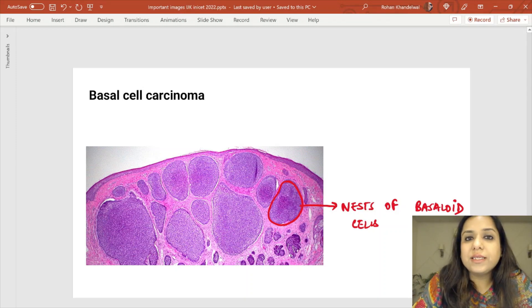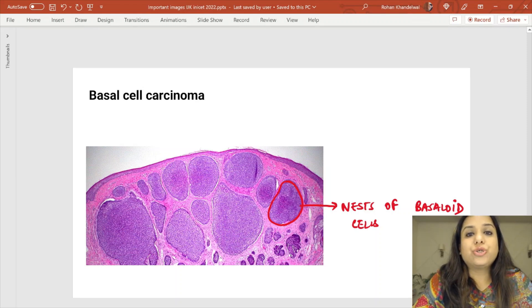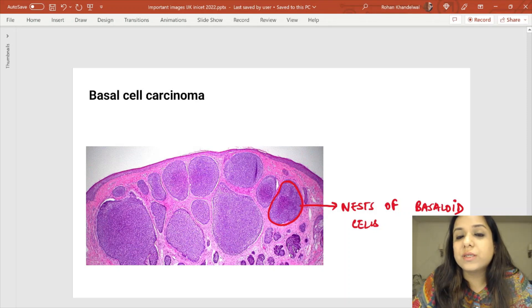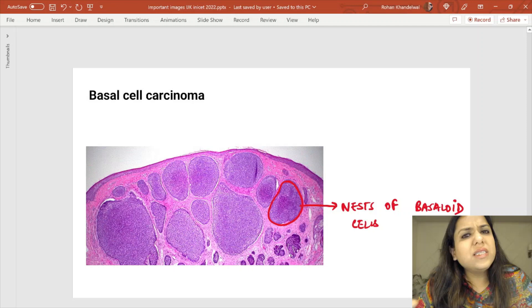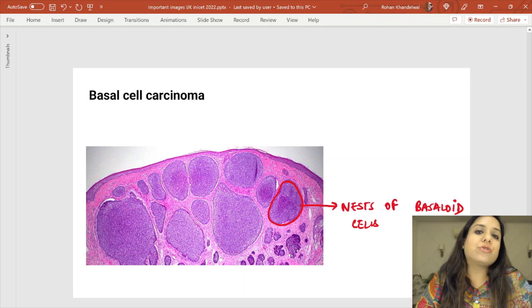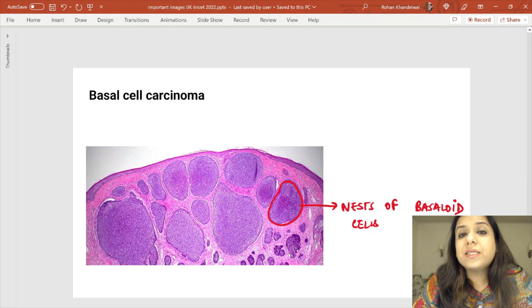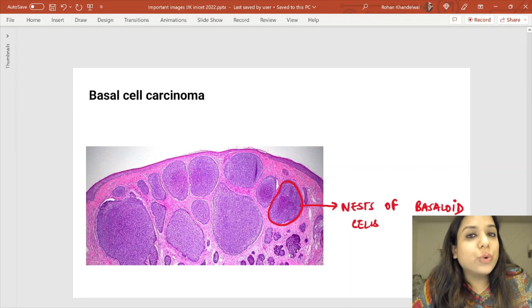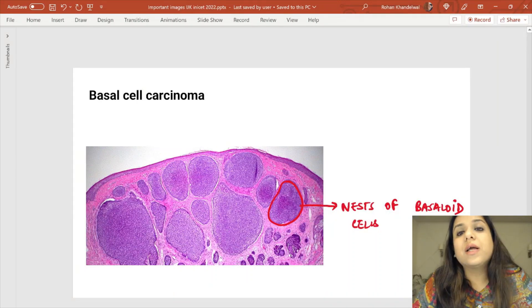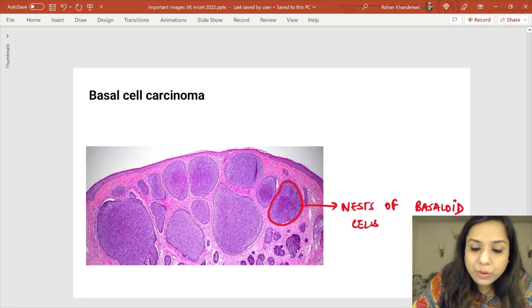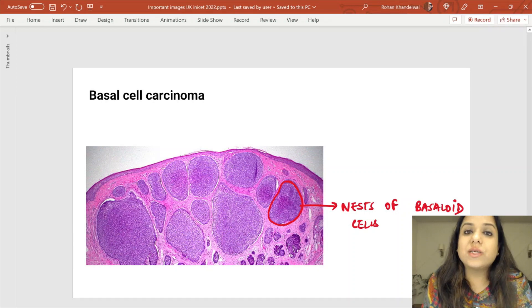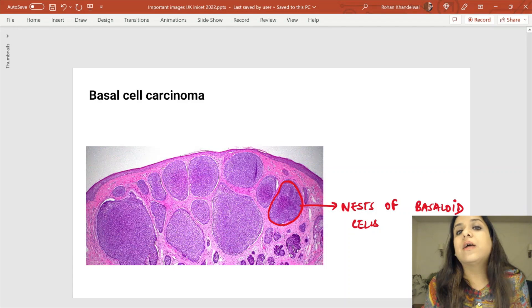On skin cancer: in the last INICET exam, there was a question about a patient with an ulcerated lesion on the tip of the nose. The biopsy showed nests of dark basophilic basaloid cells — these nests of basaloid cells are seen in basal cell carcinoma of the skin, also called rodent ulcer. Another important feature of basal cell carcinoma is peripheral palisading — at the edges, nuclei are arranged in parallel like a fence.